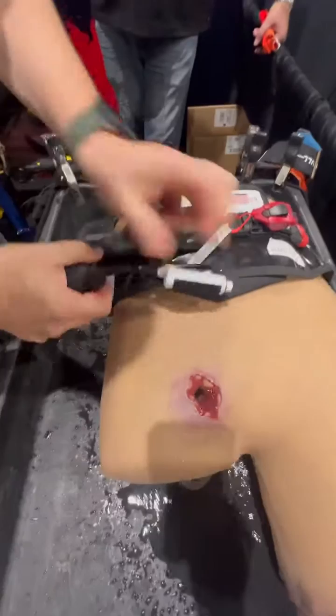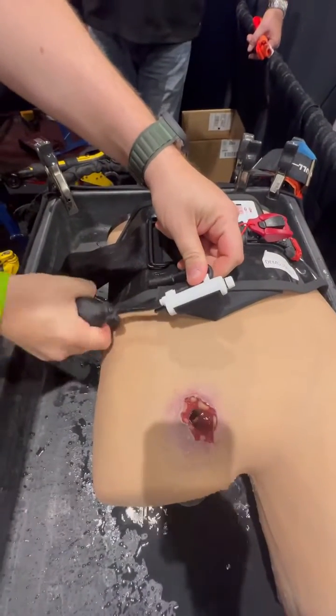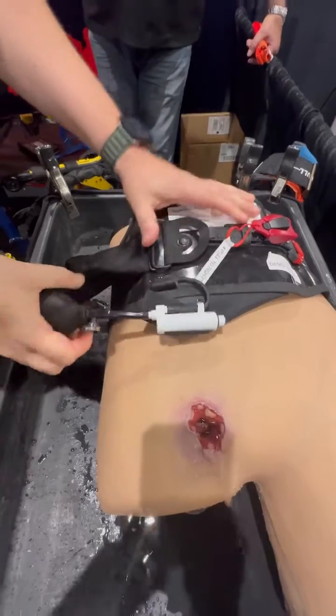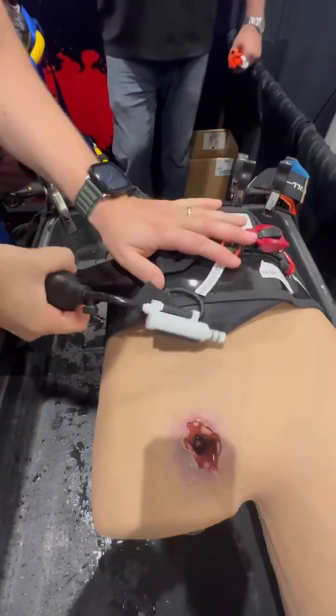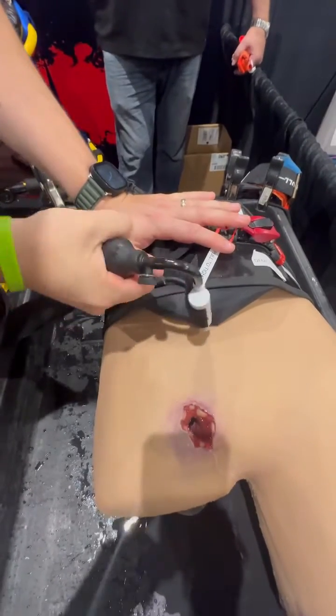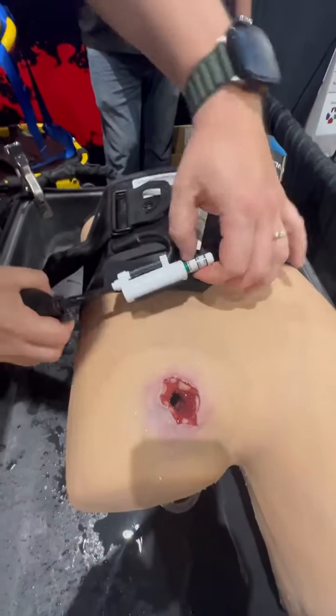Right here I'm going to inflate until I get to 250 millimeters of mercury. This is where we're inflating this massive balloon that will help control this very difficult pelvic bleed. As I can see here, it's starting to stop the bleed and we're at 250.